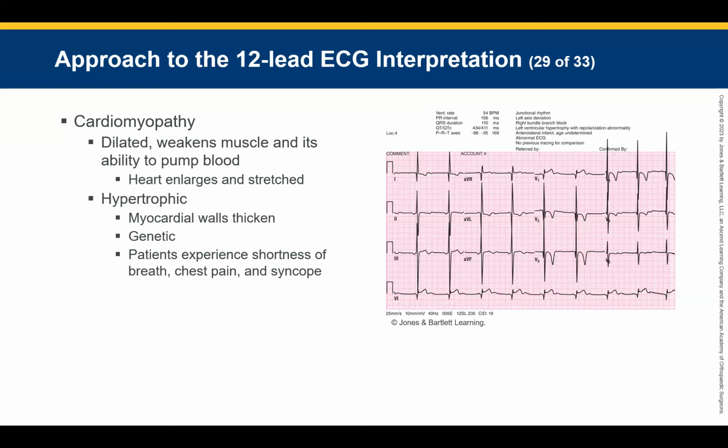And it's right. Once again, if the Doc in the Box says something, figure out why it says it. Why is it tripping up on that? Well, it was right. So we've got a junctional underlying rhythm, okay?